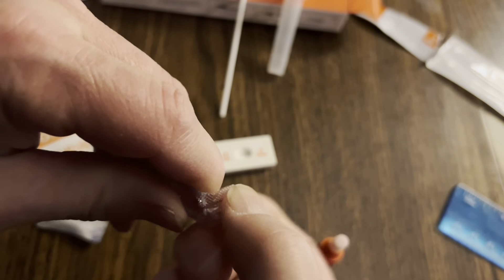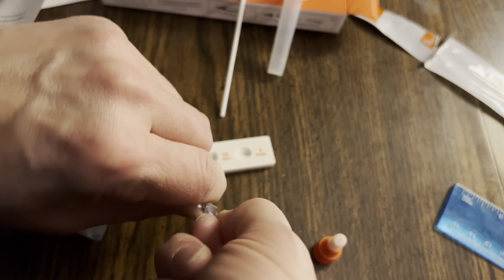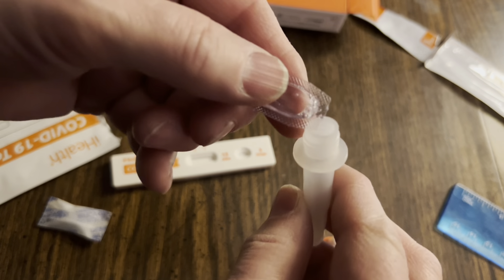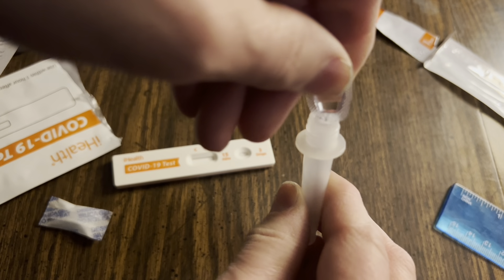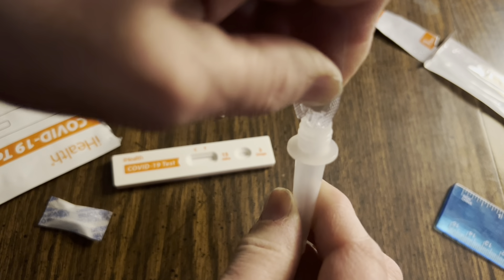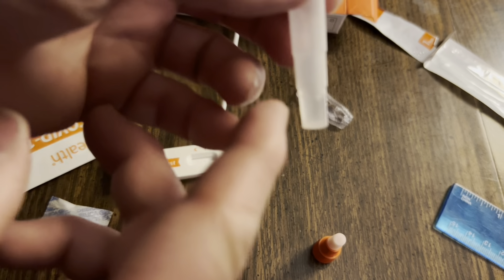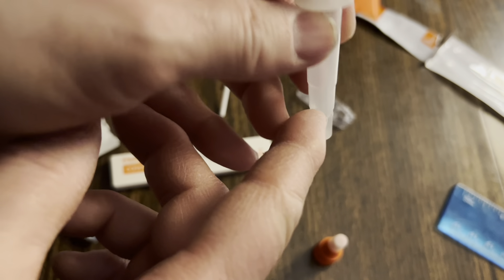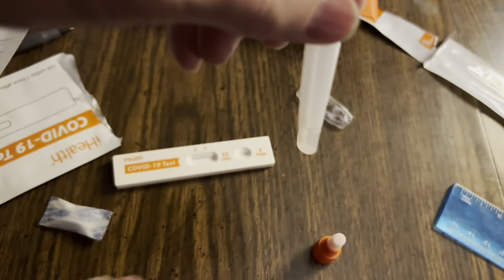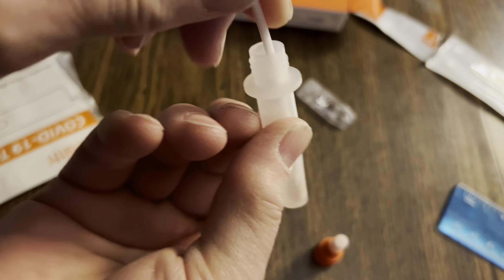Here's what we do. Put the swab down, take this, crack it open — or cut it, or twist it — like that. Take that liquid and squeeze it into the tube to get all that liquid in. When you look at the bottom of the tube, there are two little levels — this should fill up to that first level. Now take the swab and put that in there.